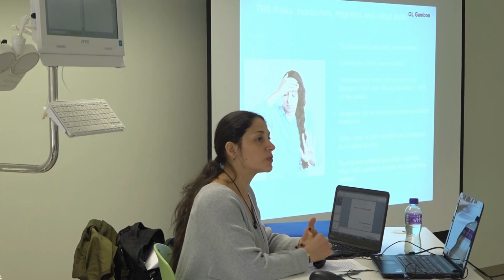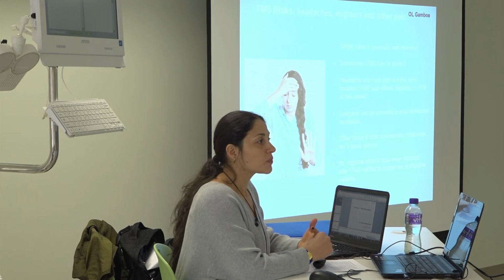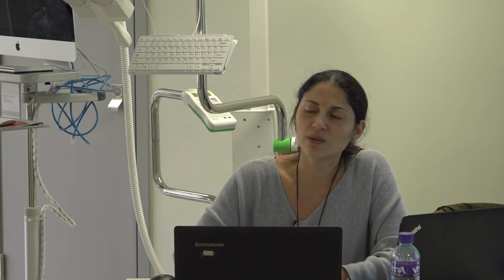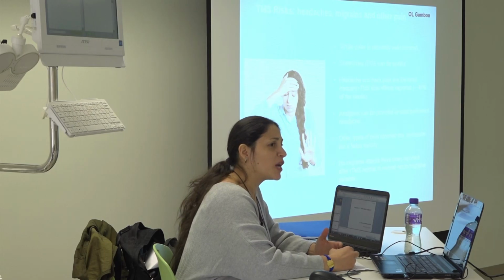There are studies that use rTMS or stimulation for treatment of migraines, so it's a treatment and it will work. Single pulse is generally well tolerated. You send a pulse and wait 4, 5, 10 seconds, and then the next pulse, so it doesn't cause so much headache. But rTMS can be painful, really depending on the area you are applying. It's really uncomfortable, and it depends on the pain threshold of the person. I am a coward and I do feel pain with these things, but there are people you can apply it to and they just don't feel anything.